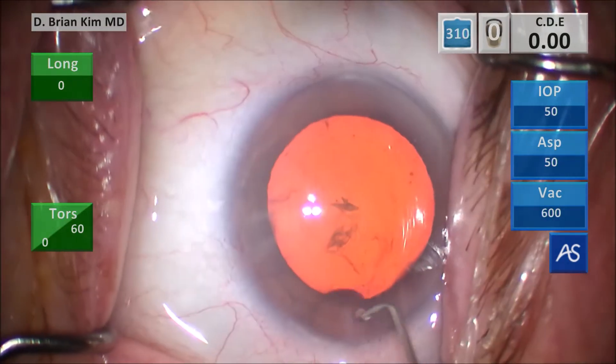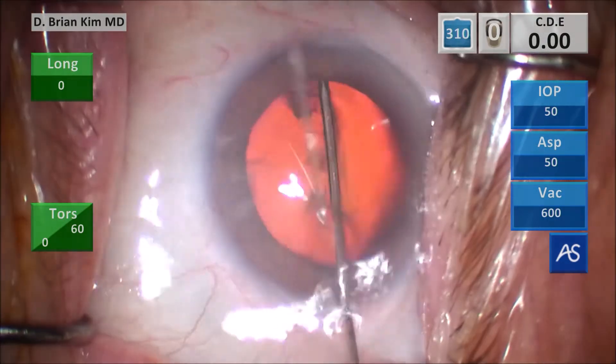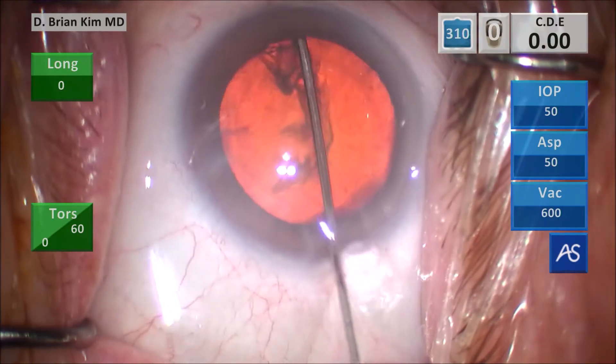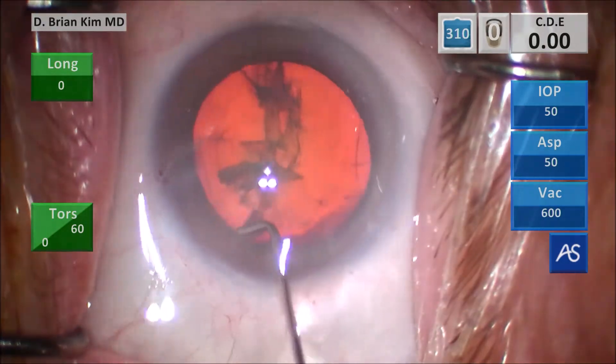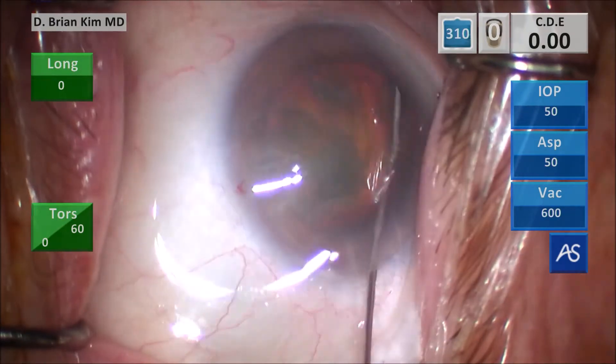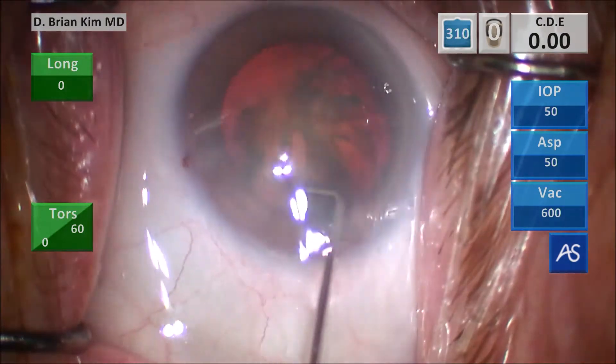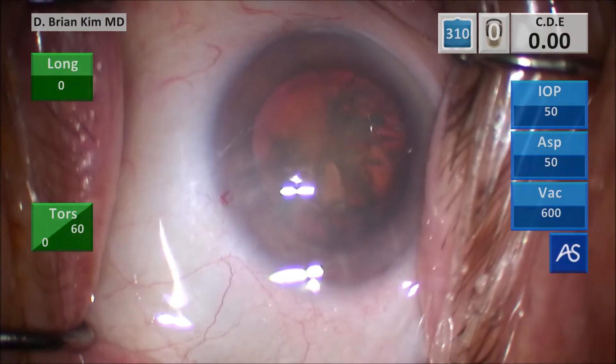This is the capsular fornix hydrodissection technique. I place a cannula under the rhexis edge contra-incisionally, get a nice wave, decompress on the left side, sweeping and hydrodissecting the anterior capsule on the left side, doing the same thing on the right side, hooking the peripheral lens, and the lens begins to spin. Irrigating the surface of the eye.